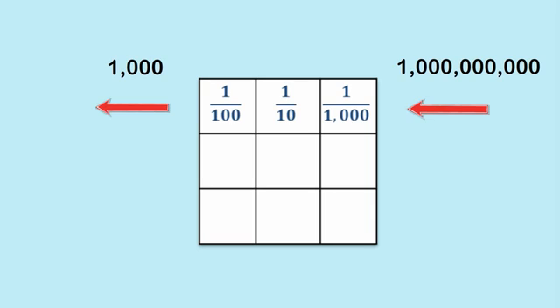One way we could get 1,000 units coming out is as follows. The first square, we have hard bone, and it only allows 1,000th of the X-ray through. So after going through the first square, we're down to 1 billion times 1,000th equals 1 million units of X-ray. The next square is fluid, and that allows 1/10 of the X-ray through. So now we're down to 100,000 units. And finally there's some muscle, which allows 100th of the X-ray through, which gives us 1,000 coming out. Now this is totally hypothetical.